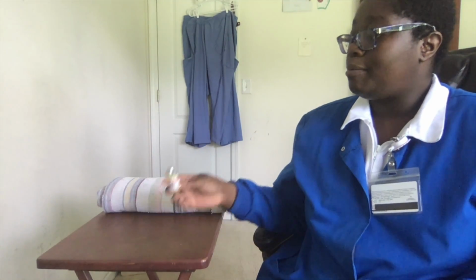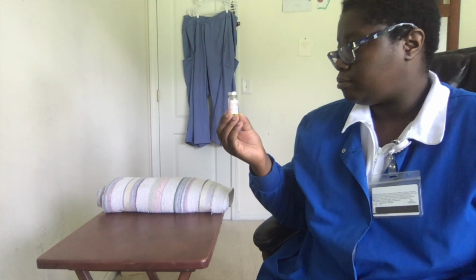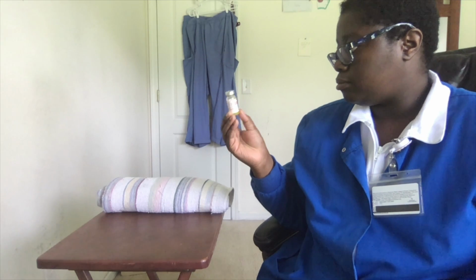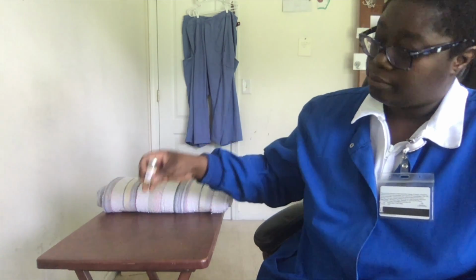Now that I've completed my first set of 5 rights, I'm going to inspect the vial to make sure it hasn't been tampered with in any way, nor has it expired. It hasn't been tampered with, and it isn't expired.